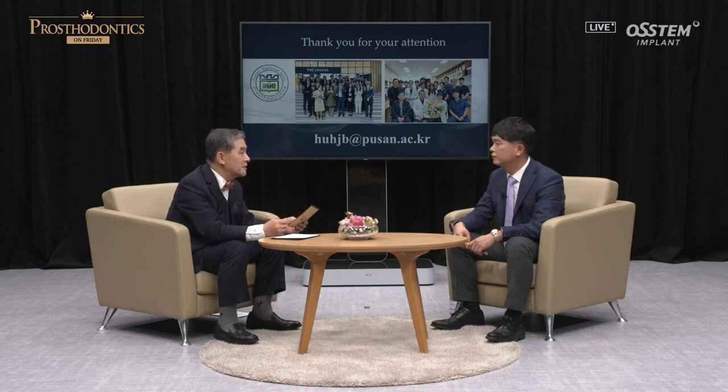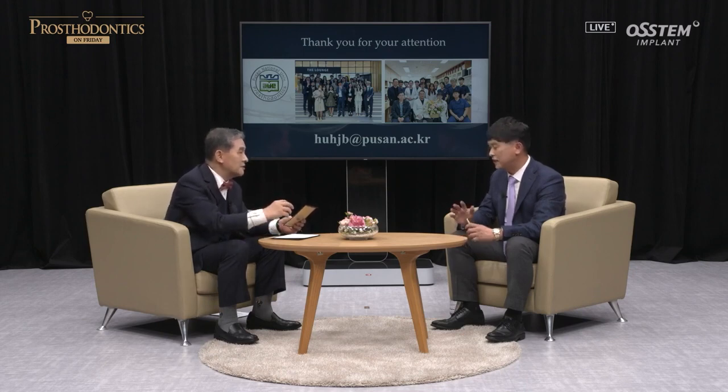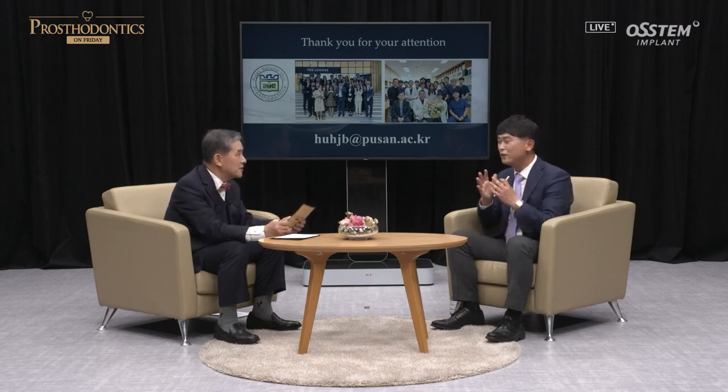As we use digital devices, in the past we had to take the impressions from the beginning, but I believe the information would be stored in the digital device. Can we talk about money? In our hospital, we charge a little bit more because we tell our patients that we can make it one more time for them. As we have the data, we tell them from the beginning they need to call us 2 or 3 days before they come to pick it up. Because I know the problem of zirconia.